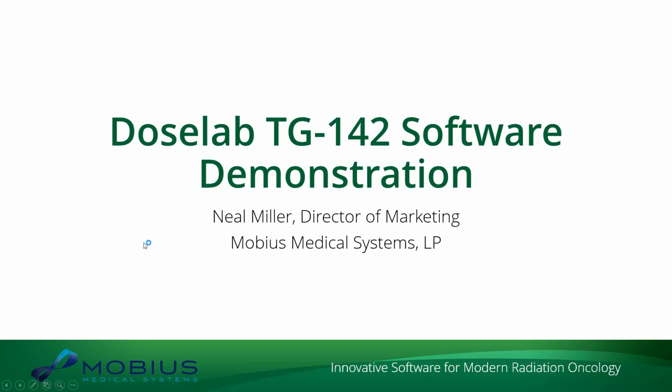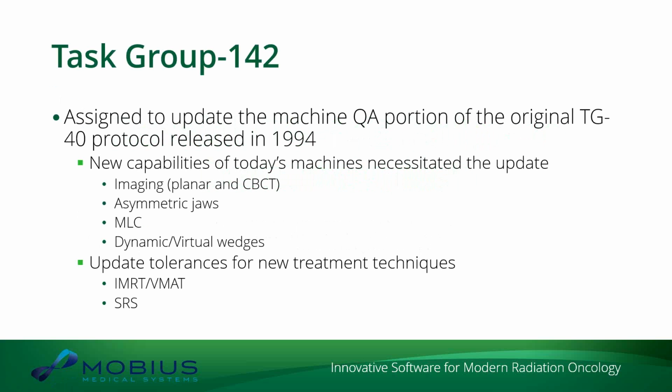So let's go ahead and get started here. Let's talk a little bit about Task Group 142. TG-142 came out in 2009. Basically, this task group was assigned to update the machine QA portion of the original TG-40 protocol that was released in 1994.